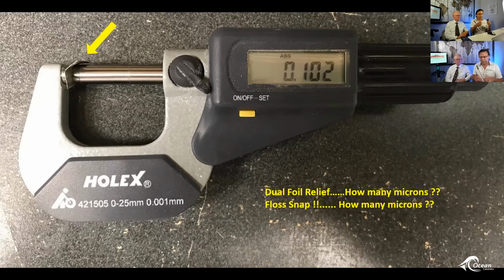You want to ask yourself, if you're testing a contact with floss, is it waxed or not waxed? Because if you're using unwaxed floss, it's a 50 micron thickness. If you're going to use waxed floss, it's 100 microns. So if you're looking for that floss snap on your contacts, check it with unwaxed floss, because that's going to be your true floss snap. If you're going to do a 1/10 of a millimeter check through a contact, it's going to yield you a false reading. So I just use the unwaxed floss when you're checking your contacts.